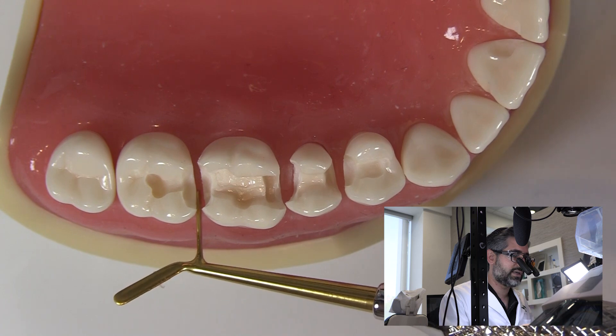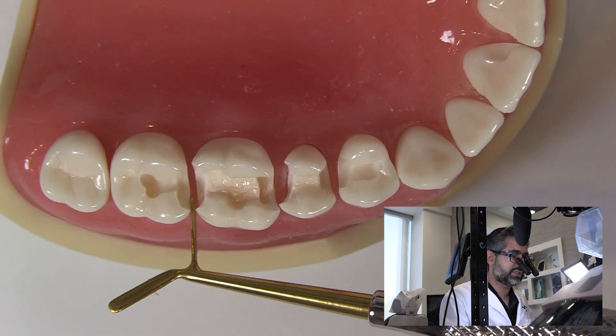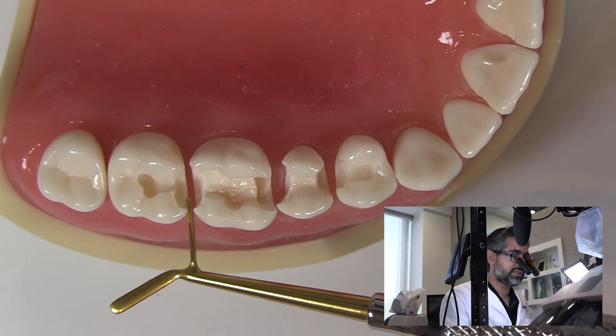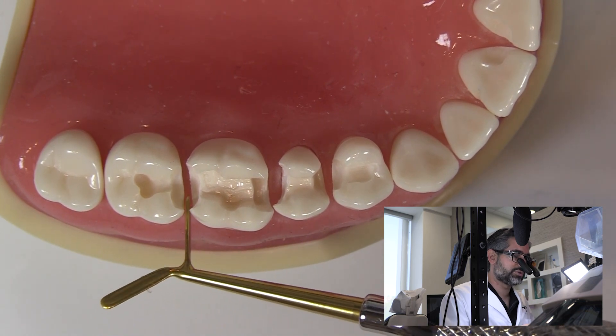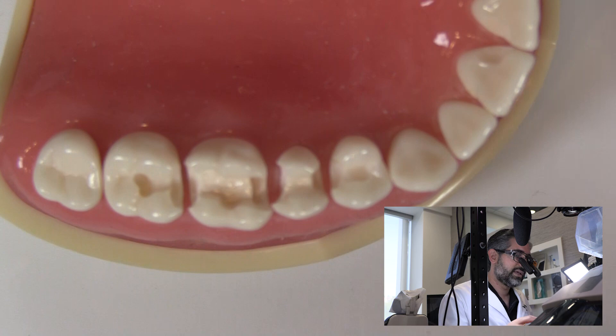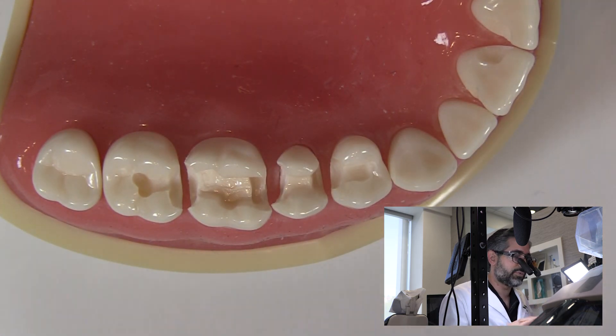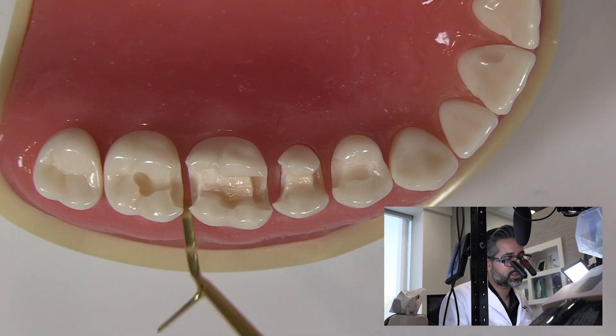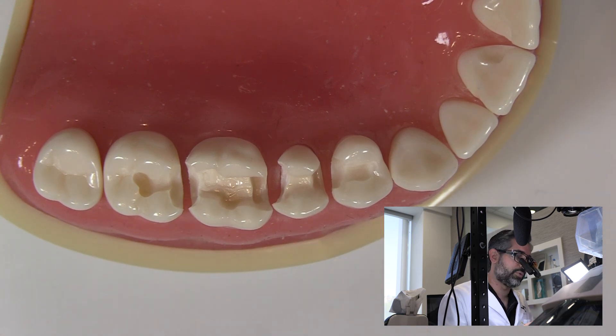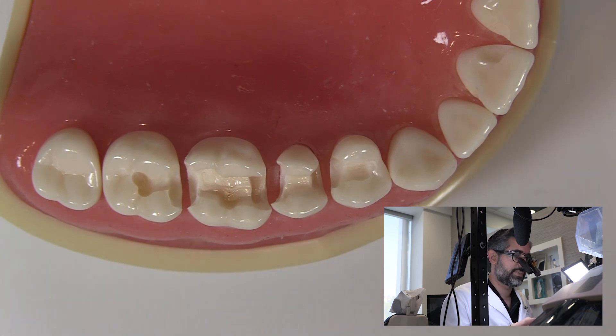Finally, I want to take a 12-blade right down here and finish this margin. No matter how good of an adaptation you get, you're going to have a little bit of flash. If I can take a 12-blade to this easily, instead of having to go between the proximal surface of two restored teeth, that's a huge advantage. Even with a finishing strip I can get down there and really polish that more conveniently. Overall, it saves more time in the finishing steps to do it this way rather than trying to work step by step on every tooth simultaneously.